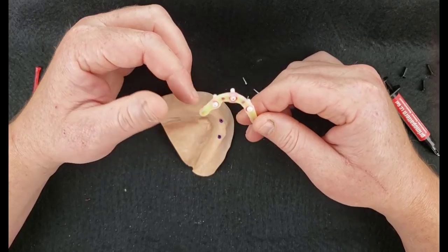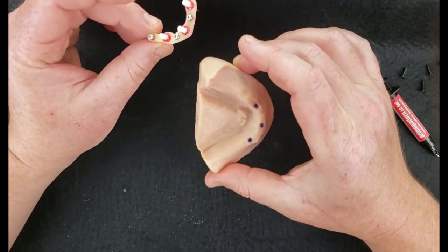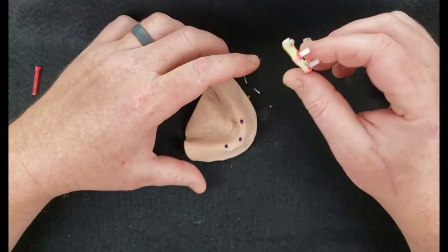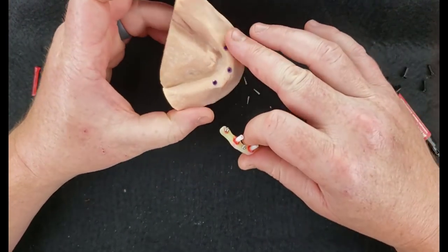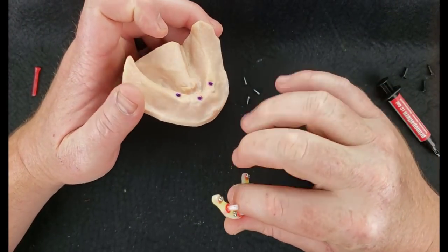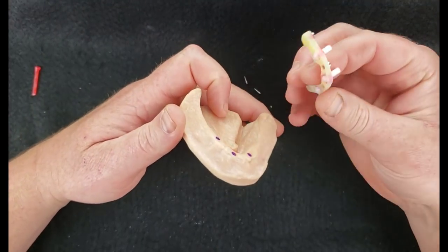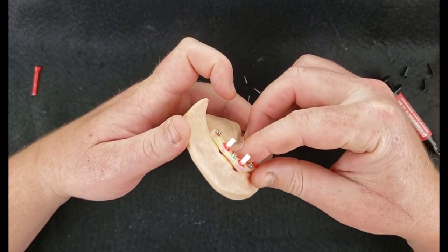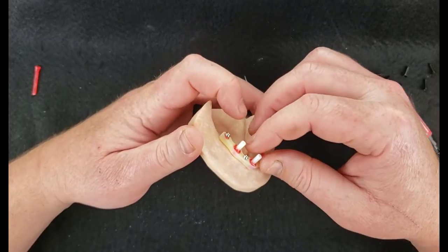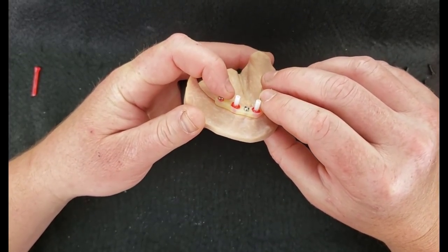The one thing you want to make sure of when you have them do the casting is that you need to send your master model and they need to do a passivity test. So hopefully you would have a soft tissue model, which I don't here, but they would be able to take that soft tissue model off, and you've got your verified impression model. They would be able to now take this and seat it on here, because what they're verifying for is they're making sure that in the casting process that nothing warped.